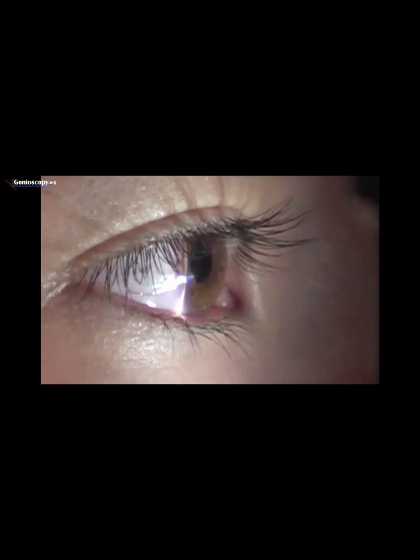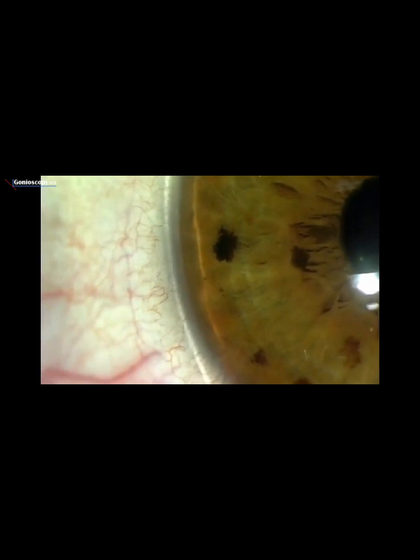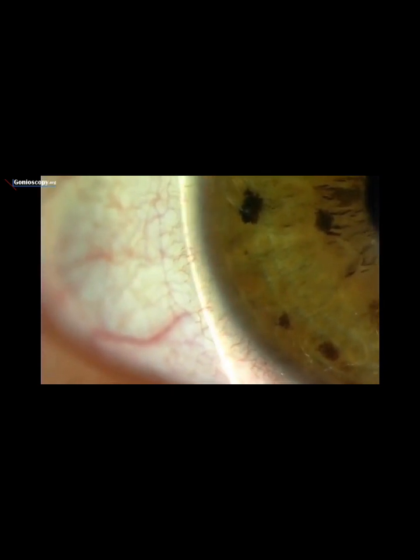And the idea is to bring a bright light in from the side, and you just want to look at it when it first reaches the anterior chamber. So dark room, very thin, very bright light. I'm bringing it in from the side here. We use the thickness of the cornea as a ruler and then measure the anterior chamber depth as compared to the corneal thickness.